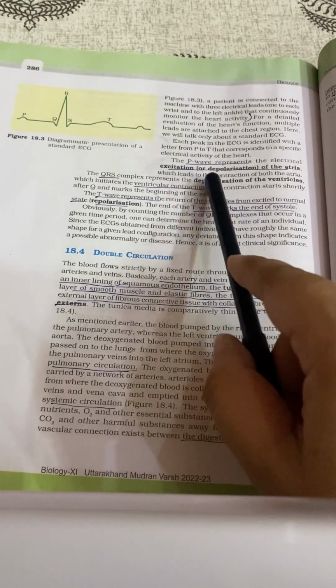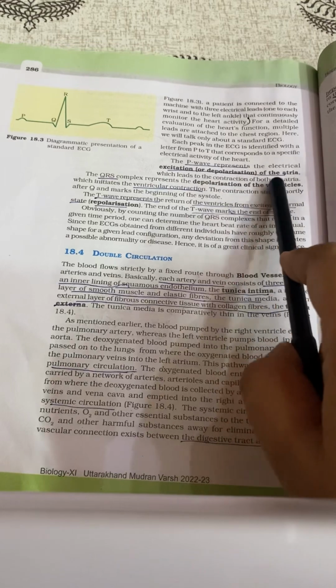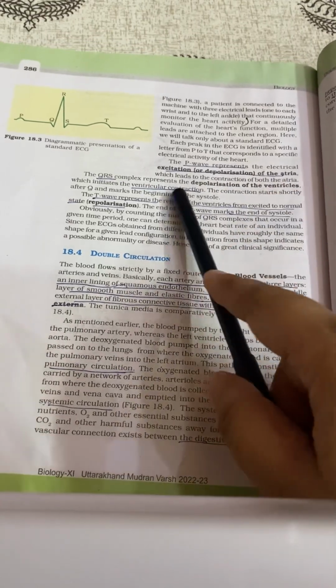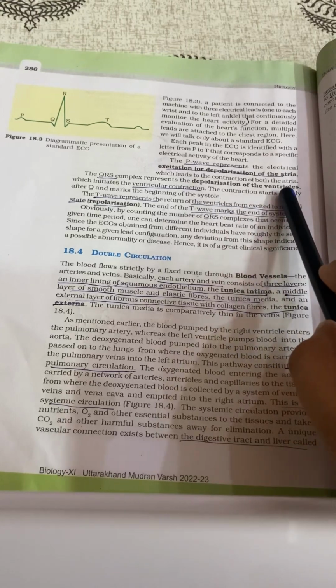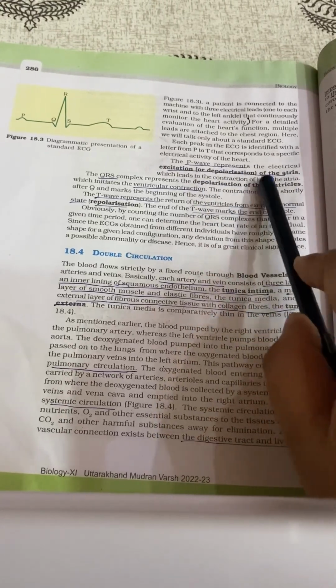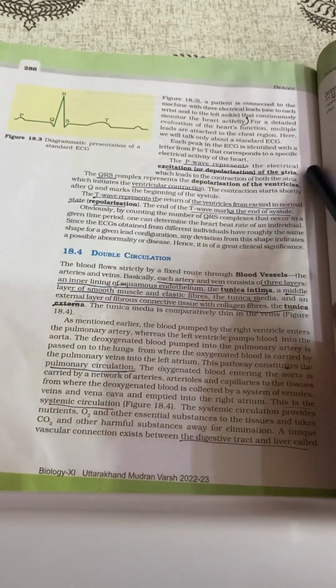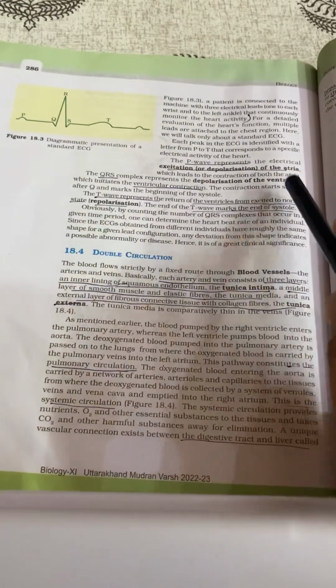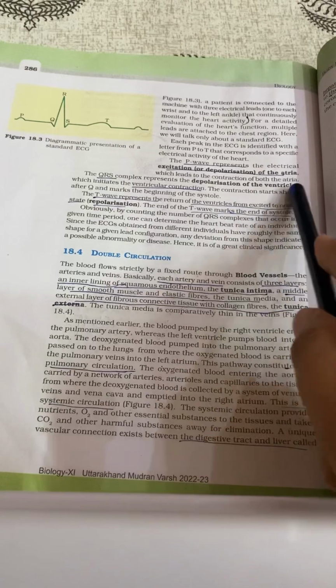So the words that have been used here are excitation or depolarization of the atria, while for the QRS they have used the words depolarization of the ventricles. So first depolarization of the atria, and then depolarization of the ventricles. And then in the ECG, first part P is related to the atria, the second part QRS is related to the ventricles, and then the third part again is related to the ventricles.